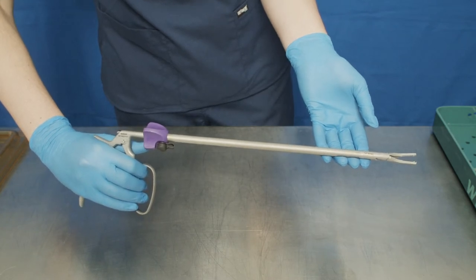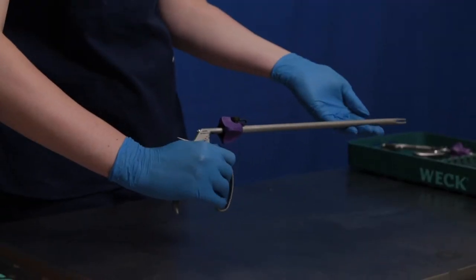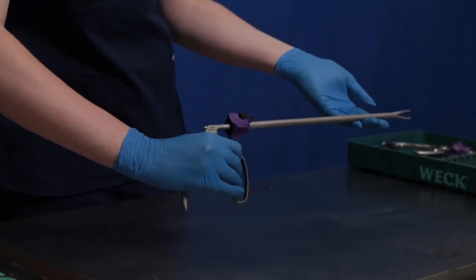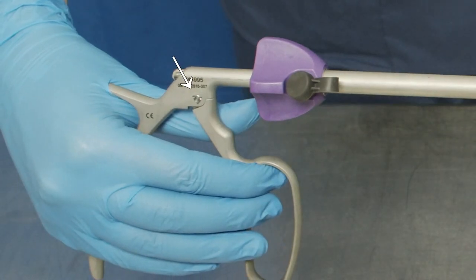All moving parts must be inspected for wear and confirmed to be functional. Confirm smooth operation during opening and closing of instrument handle and reinforcing screw. Confirm that the reinforcing screw is not loose.